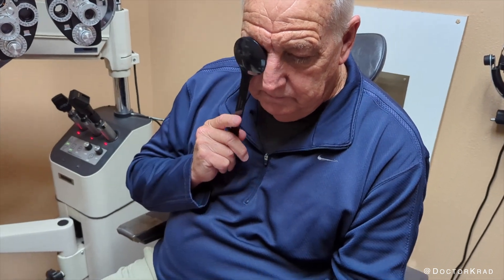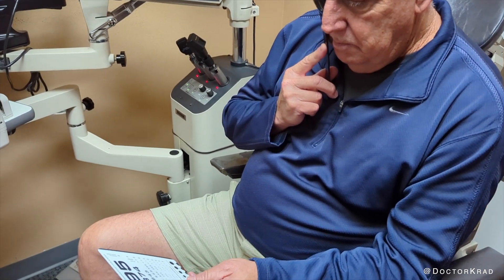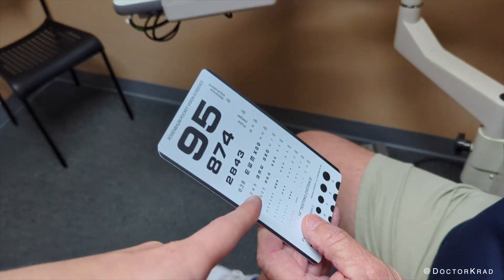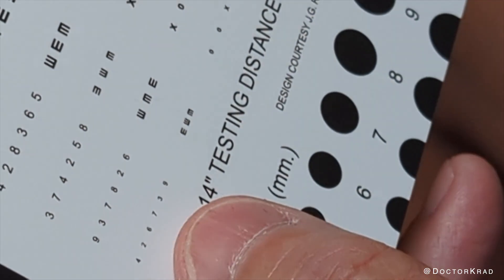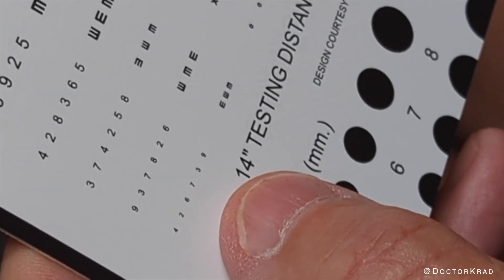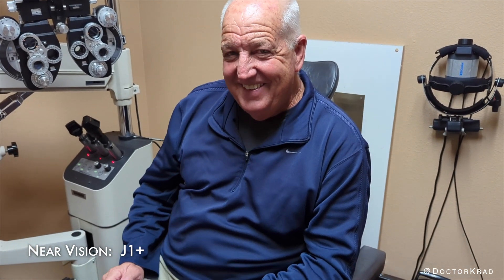You just missed one letter, but that's very good. Now I want to test your reading. Cover that right eye. Hold it a little bit closer. How low can you go on this chart? What's the smallest one you can read? 4-2-6-7-3-9. Wow. That's J1+. That's really incredible.